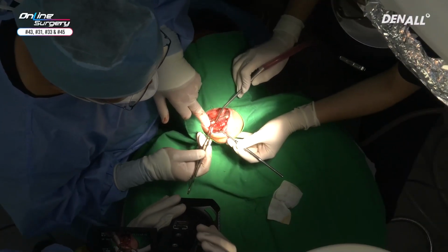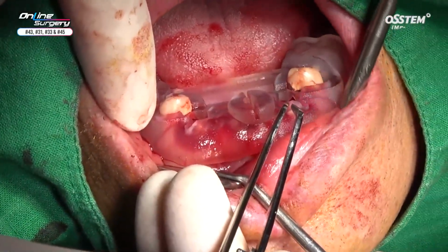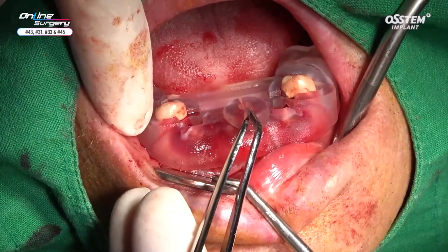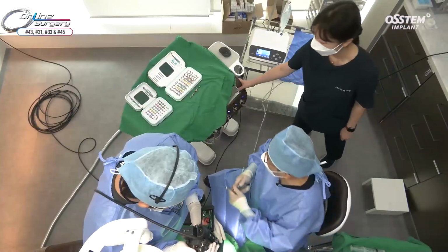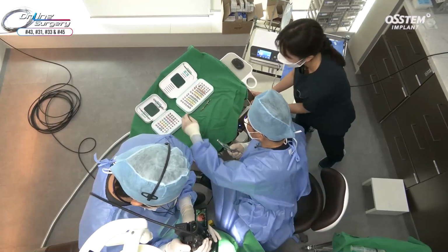For 43, 4.0 by 10 millimeters, and for 33, 3.5 by 10 millimeters. And for this, MS implant 3.0 by 10 millimeter will be placed. Because it's all extraction socket, there's no need for tissue punch or flattening drill.